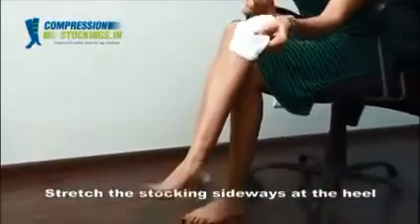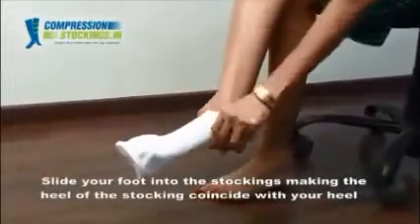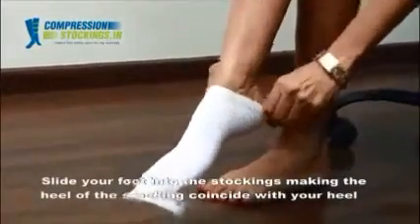Stretch the stocking sideways at the heel. Slide your foot into the stocking making the heel of the stocking coincide with your heel.